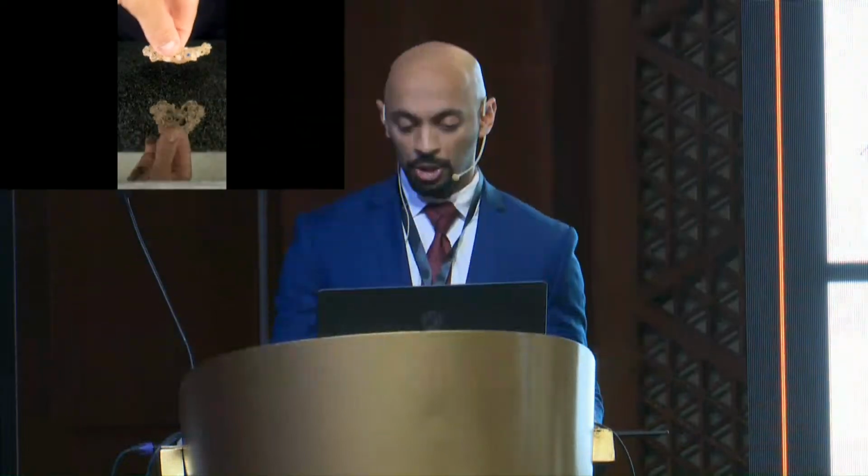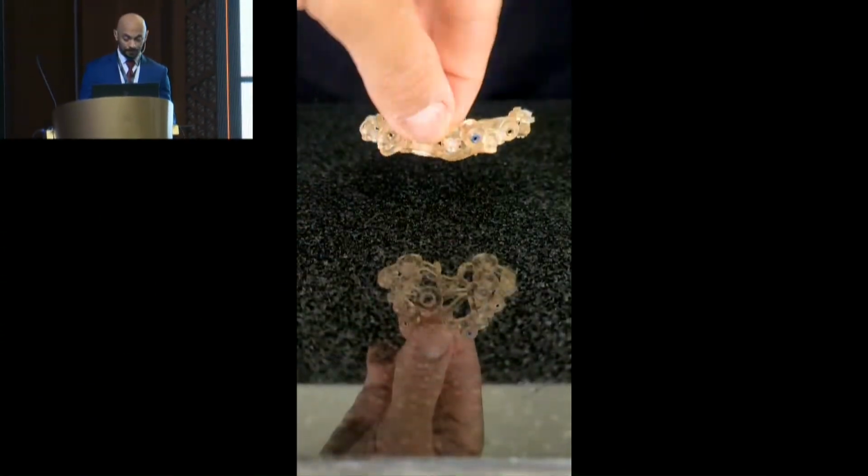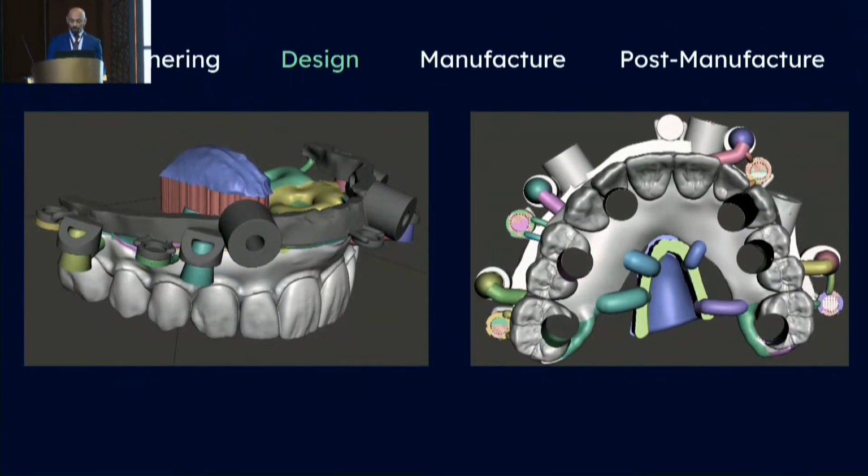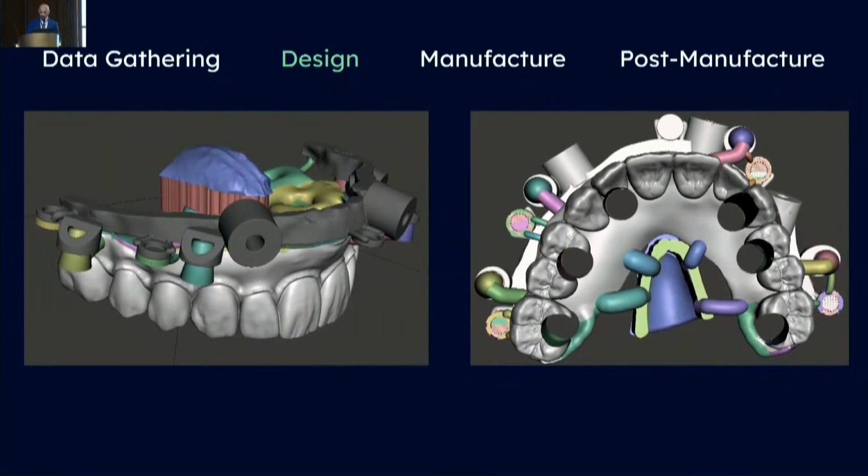And so the second implant placement guide was designed to fit magnetically and mechanically to the bone reduction guide as seen in this video. Moreover, for immediate loading and based on the aesthetic design shown before on the facial scan, an immediate load prosthesis was designed to also stack magnetically, allowing for easy and hands-free loading of these implants. Let's see how that actually worked out.